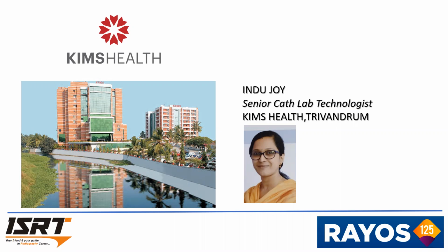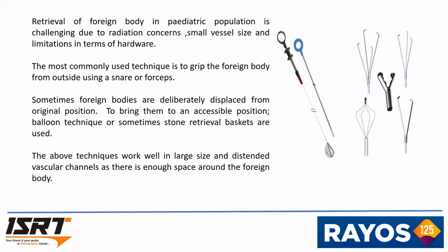My case is a percutaneous retrieval of foreign body in neonate. Retrieval of foreign body in pediatric population is challenging due to radiation concerns, small vessel size, and limitations in terms of hardware. The most commonly used technique is to grip foreign body from outside using snare or forceps. This is the picture of a snare. This is a forceps and it will be like this.